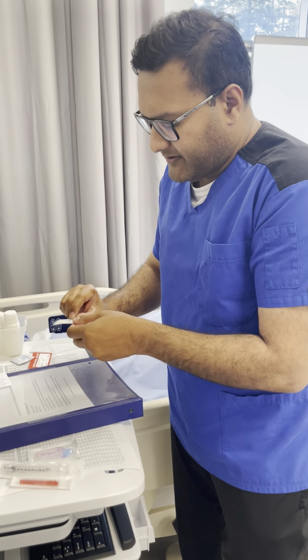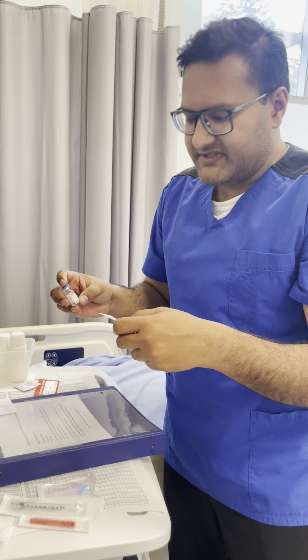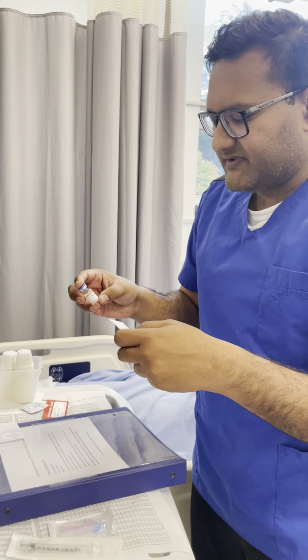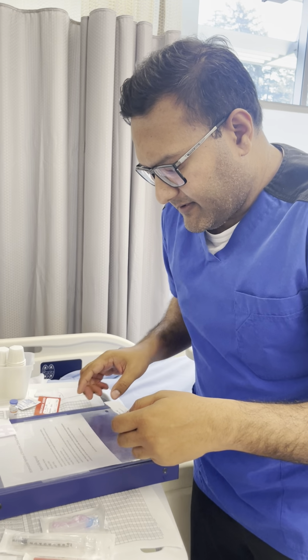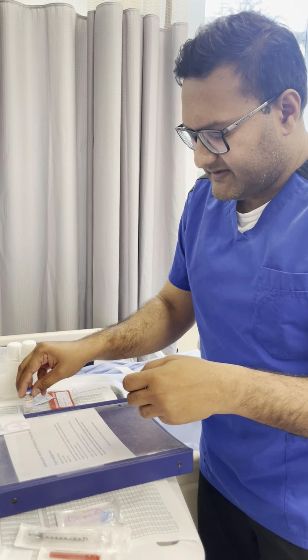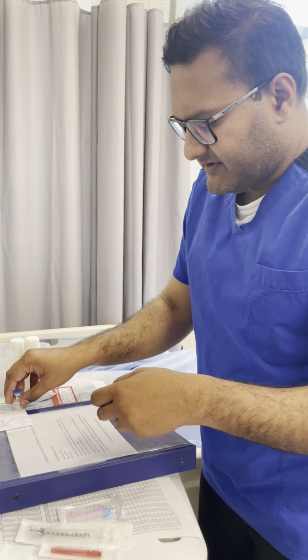I did ask the nurse in charge to get morphine. Morphine is a controlled substance, and so as a narcotic, it is something that I will have to ask my nurse to retrieve for me. With morphine, the vial that was given to me is 10 milligram per ml, and so with my calculation, my patient requires 6 milligram, which means I am to retrieve 0.6 ml for the right dosage.